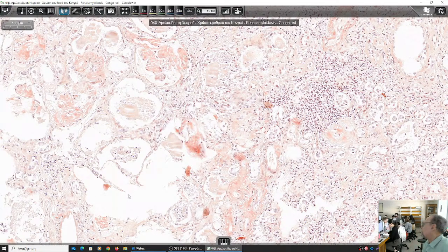These are atrophic tubules. And how can you tell that they are atrophic? They have become microcystically dilated, and their epithelial lining is no longer visible. It has become flattened because it did not receive enough blood.